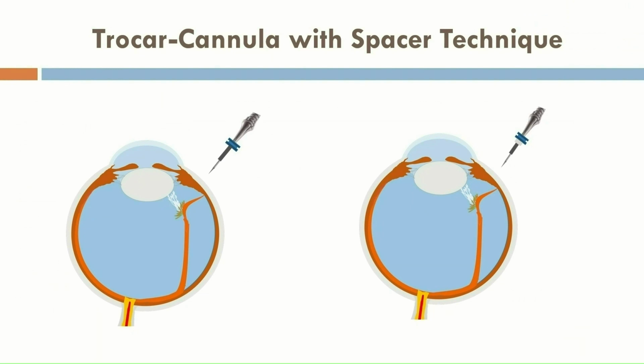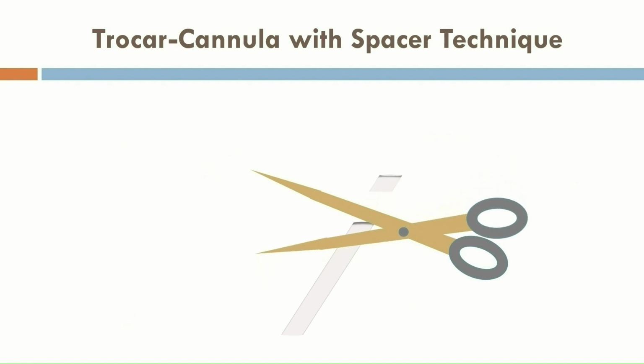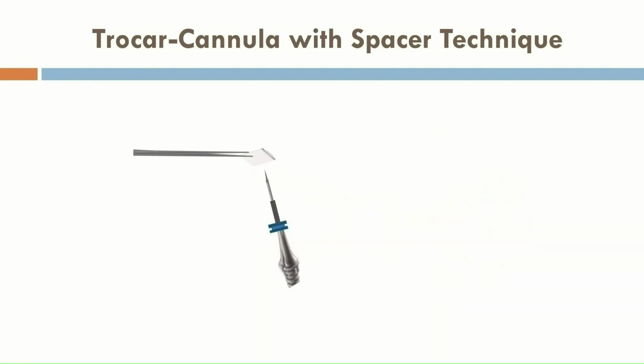In the spacer technique of modified trocar cannula entry, a spacer is used under the hub of the cannula, thus reducing the length of trocar entering the eye, and hence reducing the risk of retinal injury. A spacer is created by cutting a 2 mm wide end of a 42 silicon band, and then bisecting it into smaller 2 by 2 mm squares. Each trocar and cannula is pierced through the silicon piece, holding it with a toothed forceps, till the hub of the cannula.